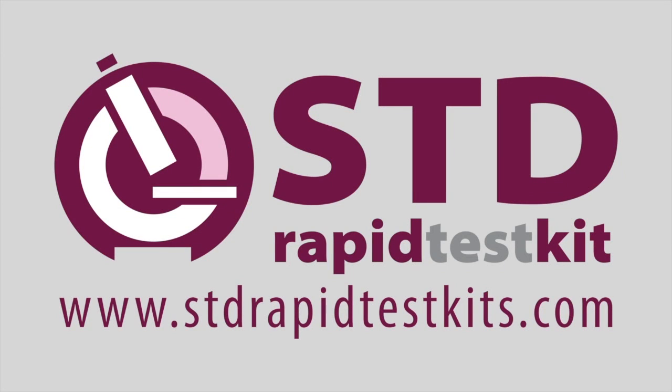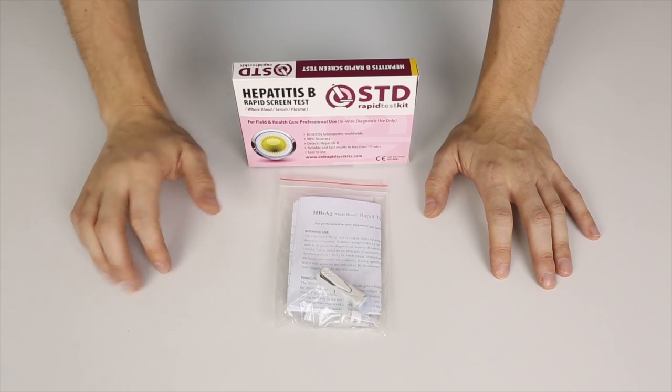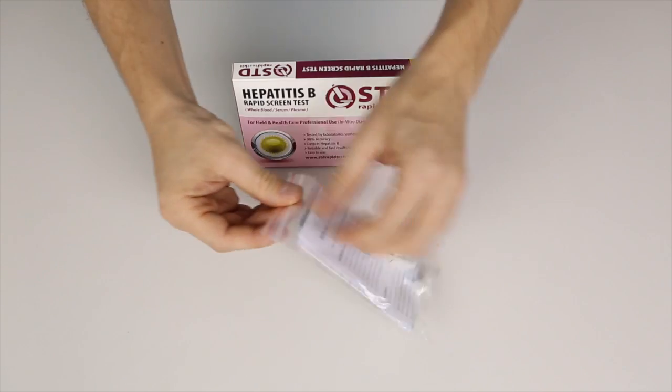Hello everyone and welcome to the tutorial for the STD Rapid Test Kit of Hepatitis B. We're going to do this procedure now and carry it out step by step and hopefully this will help you. This is the pouch, this is the entire test, and all the parts are included here — this is all you'll need.